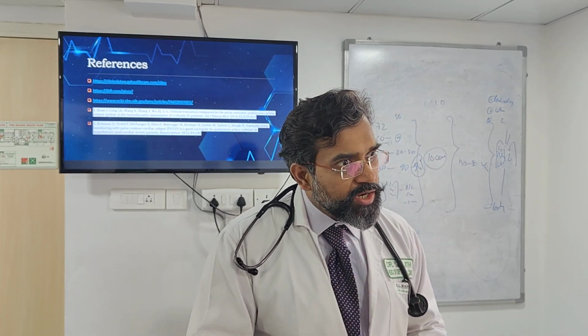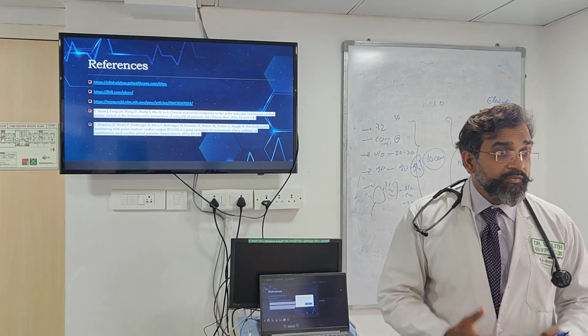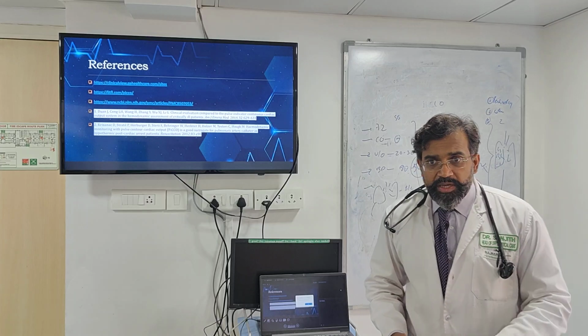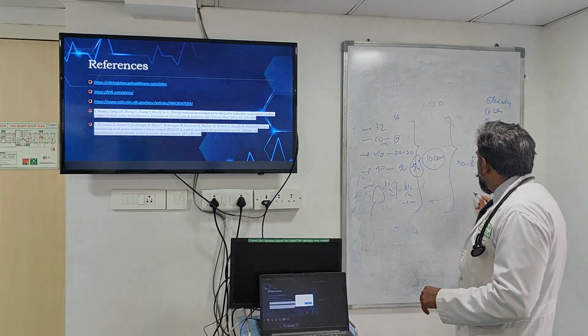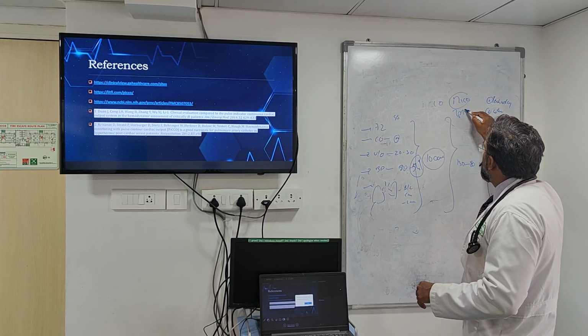But there is a larger chance to say there is pulmonary edema if I have a device that actually tells me this is pulmonary edema. So when I put a device in place and I figure out that there is pulmonary edema, that device is called Picco, or the technique is called transpulmonary thermodilution.